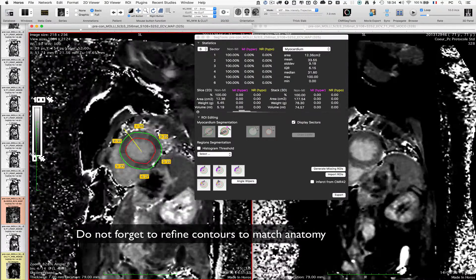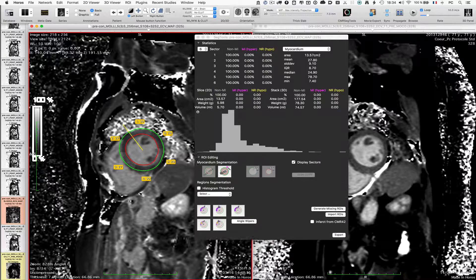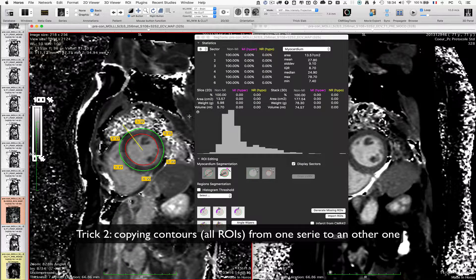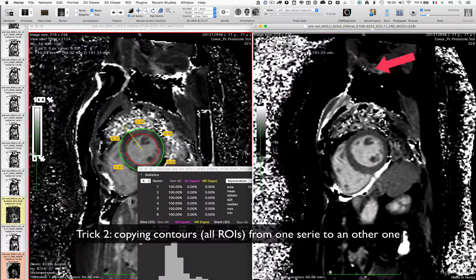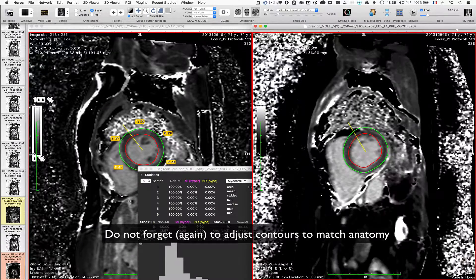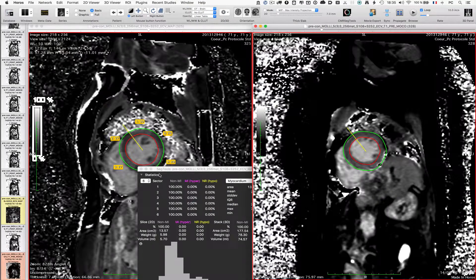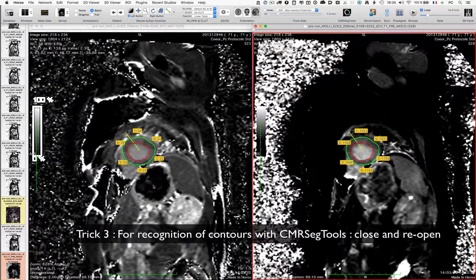There are some small errors that I will be able to modify with the repulsor tool. Now I would like to show you how you can spare a lot of time by copying these contours, by clicking the icon here and dropping on the other set of images. Of course there were some errors copied on the other side, but these slight changes can be quickly modified. To update, close and reopen each of the series.